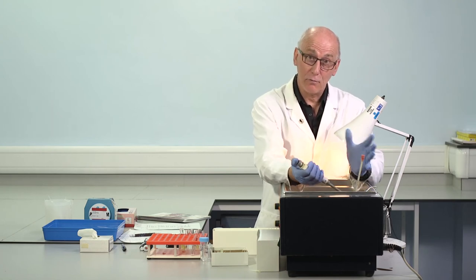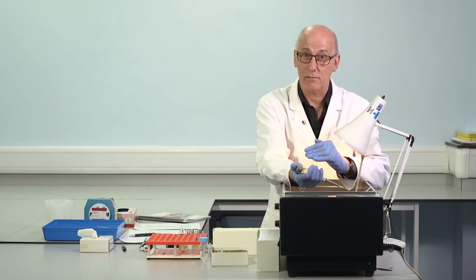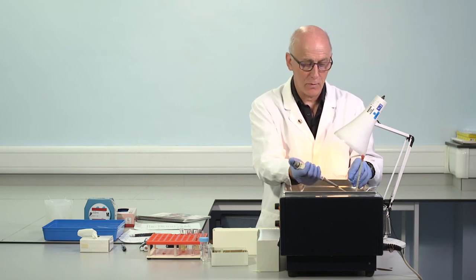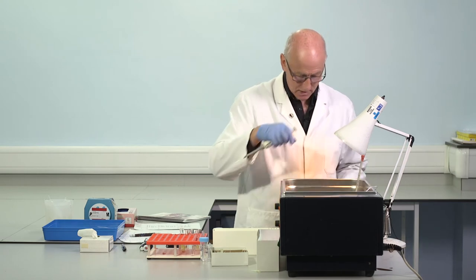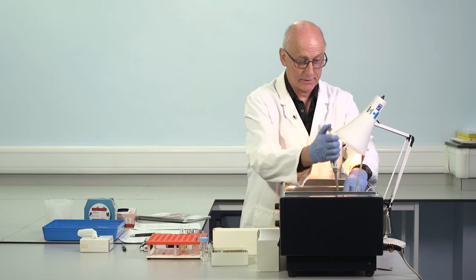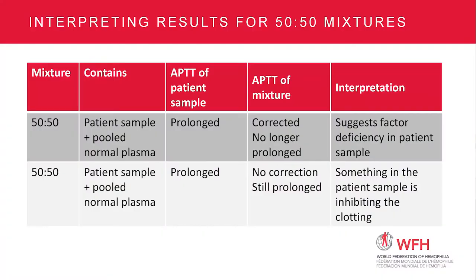Let's start the APTT on this. And of course the mixture, equal volume patient and pooled normal, so the level in this mixture is intermediate, halfway between whatever is the patient level and whatever is the pooled normal. APTT to the first one, and mix, and to the second one. So if it doesn't move, same degree of prolongation, we're thinking about inhibitors. If it moves back towards the normal range, we're thinking much more likely a deficiency.